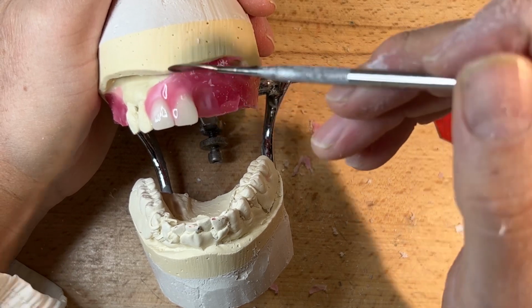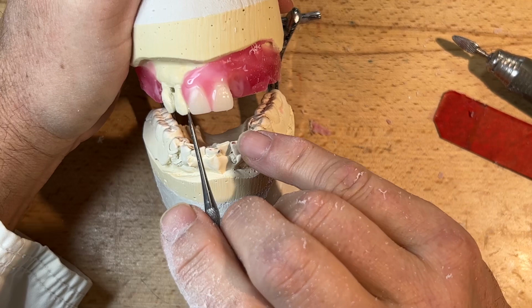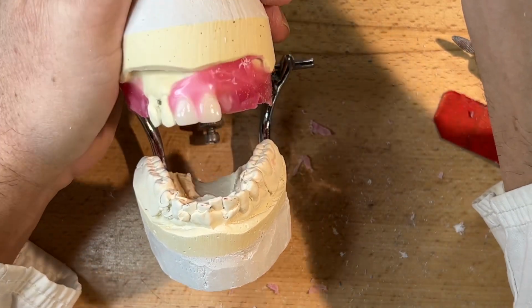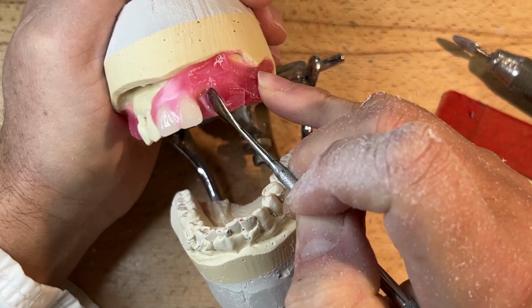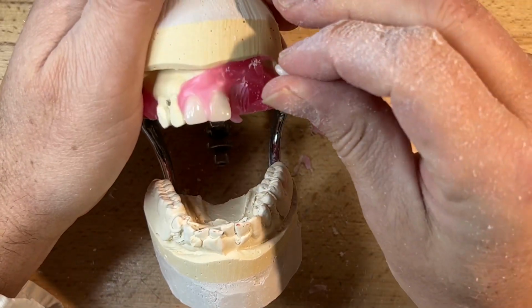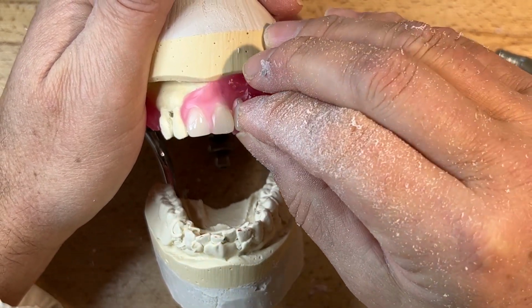The space of the central brought me to the midline. And sometimes we can't have this. If these have drifted over, we'll leave a diastema here for the try-in and then consult with the client that this diastema is going to be closed upon the immediate completion of the full upper. But this one seems to be pretty helpful here. It seems like I have more room now from the ridge, other than the centrals, tucking them in.